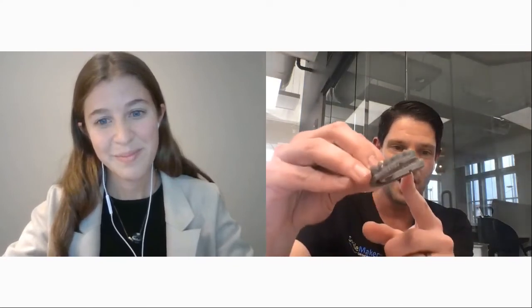And if my assistant was like, well, why are you printing hollow? And I'm like, to save money. And she was like, well, I wish you wouldn't print hollow because then I don't have to worry about it. And she's talking about the draft resin. So I think having that little notch right there, and that's just this aligner company that I was using, that's where they put the little draining notch, I think it increases the likelihood of a fracture of the horseshoe model when you're removing it from the build plate. I think if you reposition that somewhere else, or if you just printed a solid model, it might not be as big of an issue. So some things to think about.